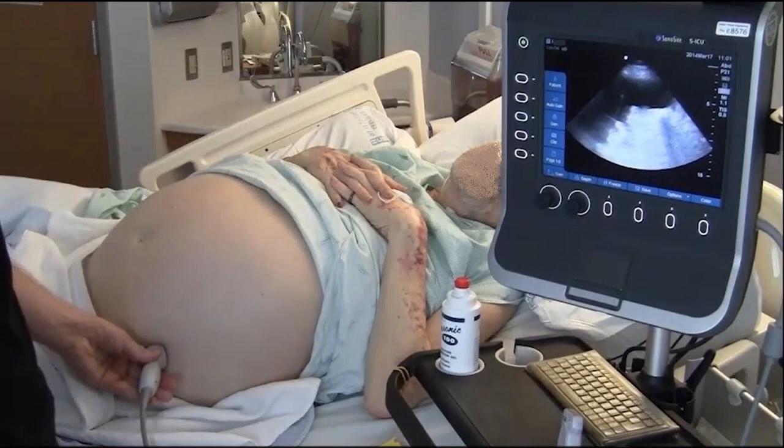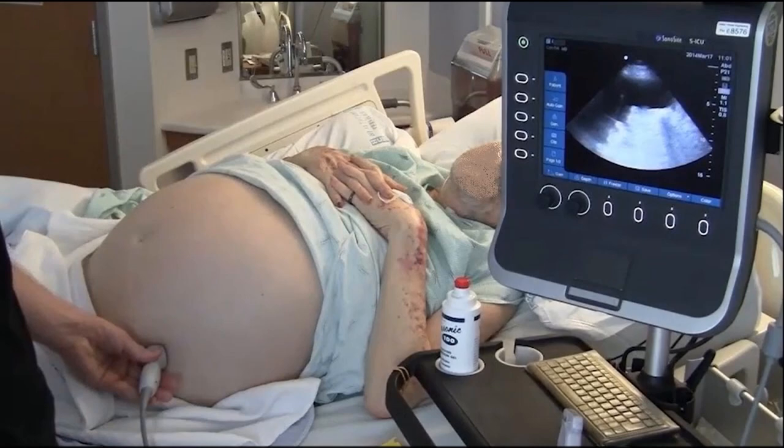Ultrasound guided paracentesis is a common procedure performed in the emergency department and ICU. One of the most feared complications of this procedure is accidental vessel injury leading to hemorrhage. Ultrasound is typically used to find a suitable pocket of ascites. However, textbooks rarely mention that ultrasound can identify the inferior epigastric artery to prevent inadvertent vessel puncture.